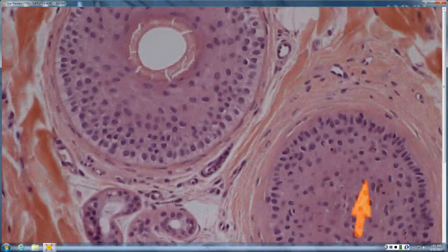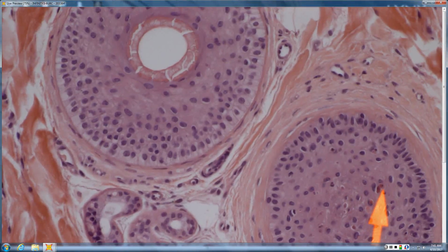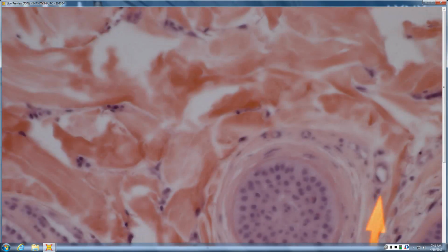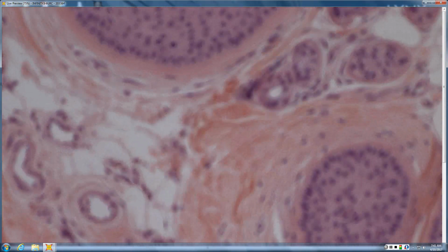What kind of hair is this with all those dead reds in it? A hair that has lots of apoptotic, dying keratinocytes, would that be A, growing, B, stable, C, shrinking? Shrinking. Correct, which is catagen. So all these dead reds means it's in an active state of shrinking. So that is a catagen hair. What's this one? Catagen. So pretty much everywhere I look, I see catagen hairs.